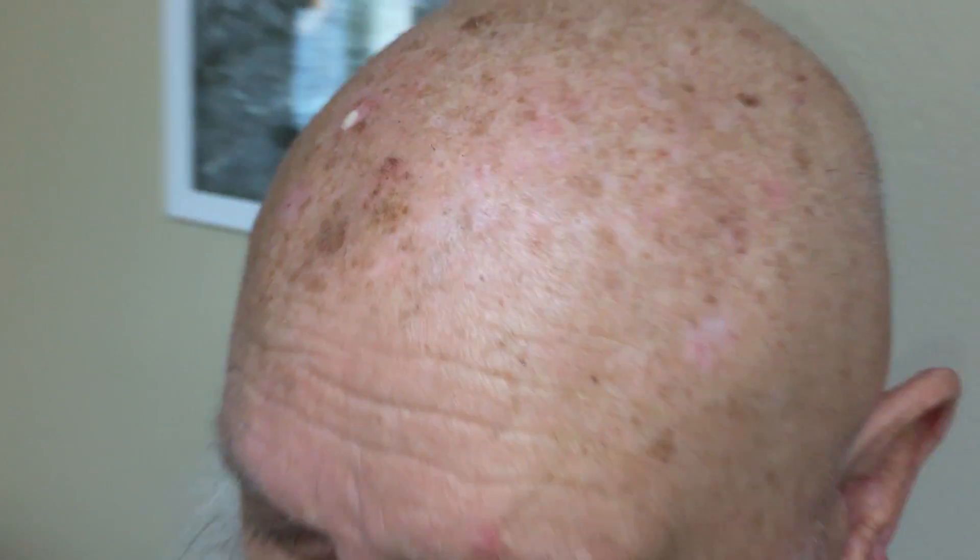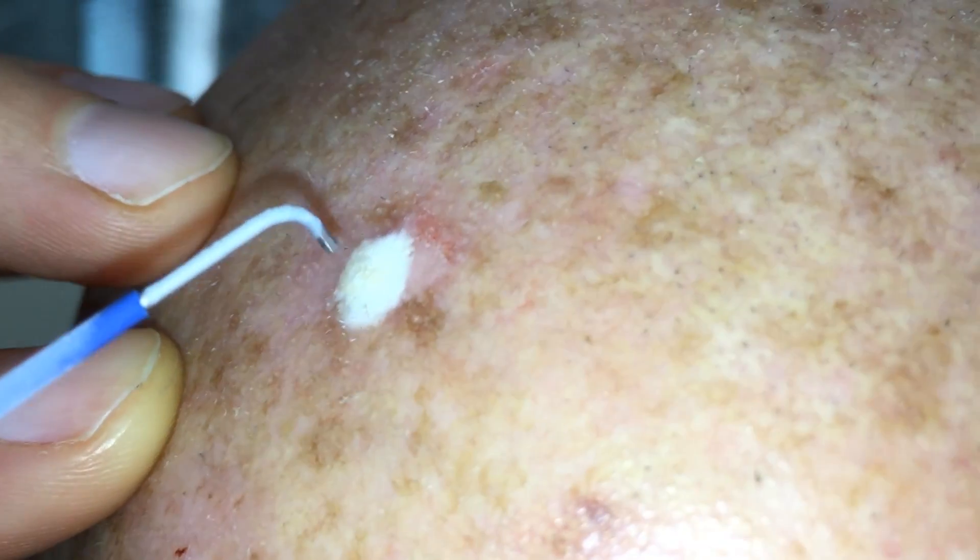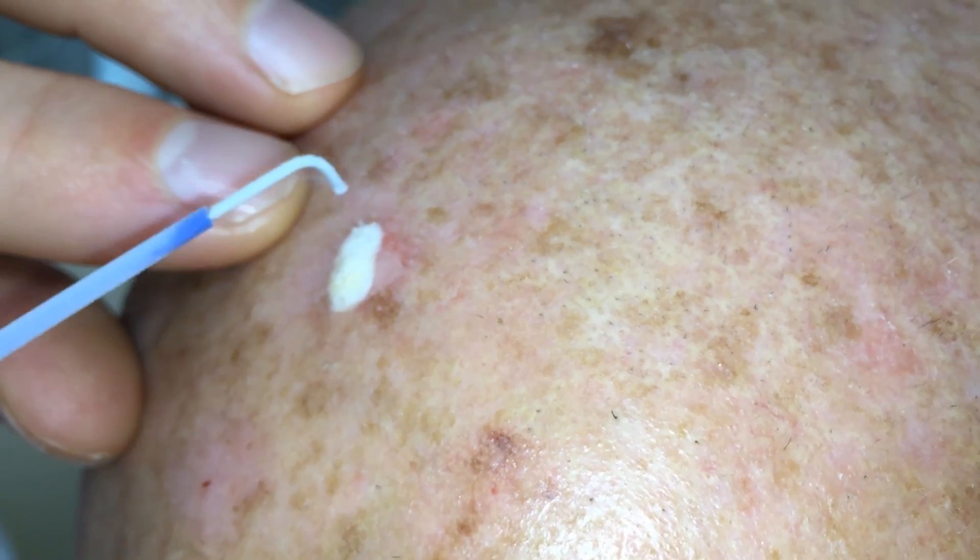You were pretty stoic with that — thank you for not kicking me. Now that the white is almost completely gone, we do the second one. Okay, here we go, number two — I'm going to get this right up here, just that little part of it.